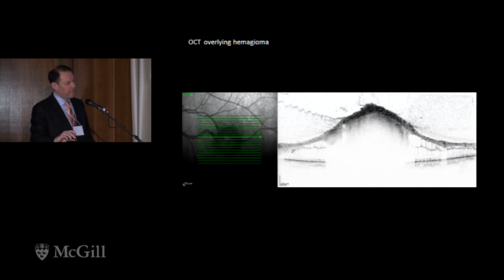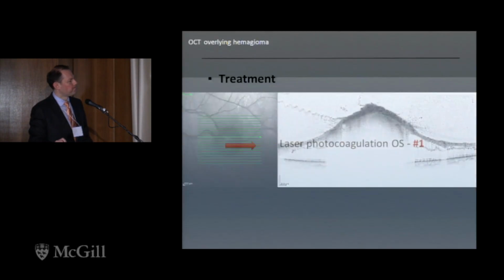When you do an OCT over the lesion itself, it really doesn't provide you with much additional information. It shows you some significant shadowing beyond it. It shows you a nice vitreous attachment. The hyaloid is still attached to the lesion. And it shows you some pretty blurry looking CME, but not much on top of that.